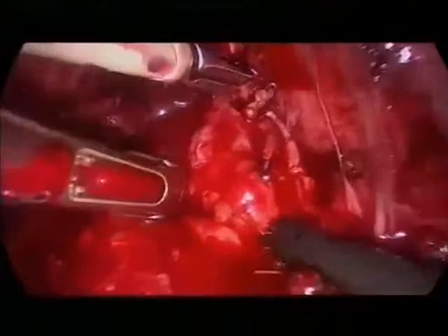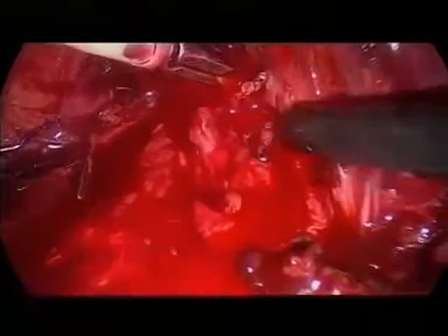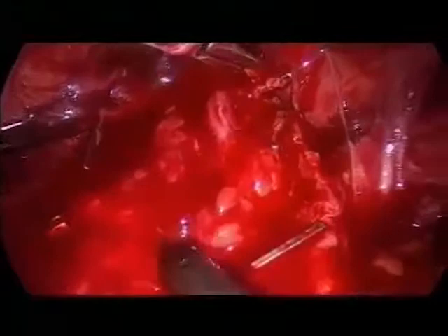You see the urethra is somewhere, and I am cutting the fibers of the bladder at this point, and I will try to make the complete dissection of the urethra before cutting it. So here you can place bipolar energy.